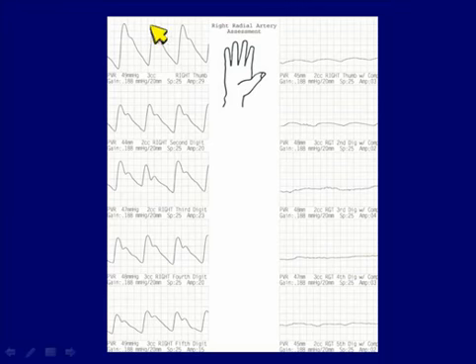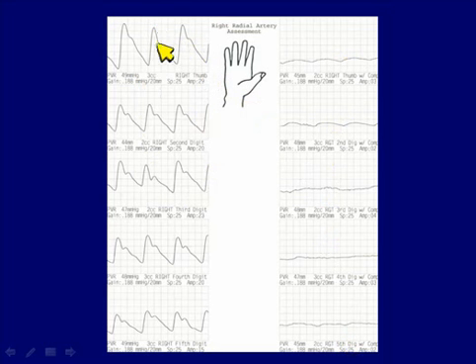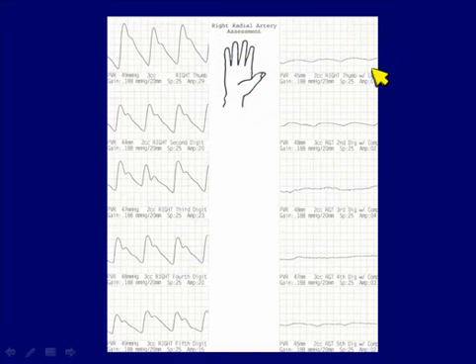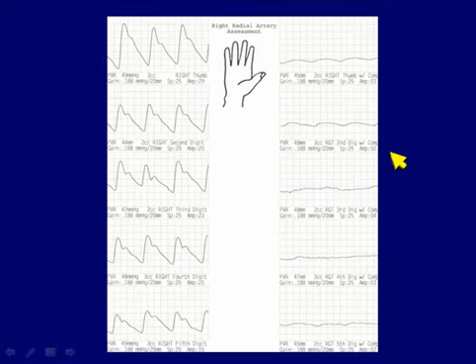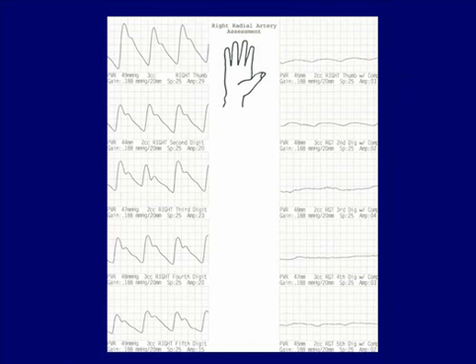Here are PVR waveforms of the digits of the right hand. We manually compressed the radial artery and repeated them — the baseline waveforms are textbook normal with sharp upstroke, narrow peak, and reflected wave. But when we compress the radial artery, the waveforms flatten out almost completely. We can safely say we don't want to harvest this radial artery for coronary bypass, because we would likely get digital ischemia. This patient is radial dominant and likely has either a small or inadequate ulnar artery not perfusing the hand sufficiently.